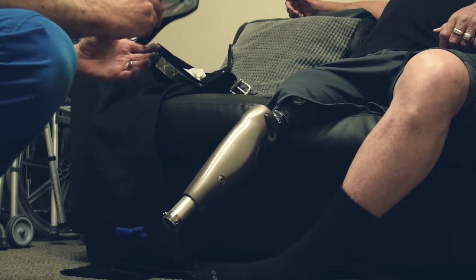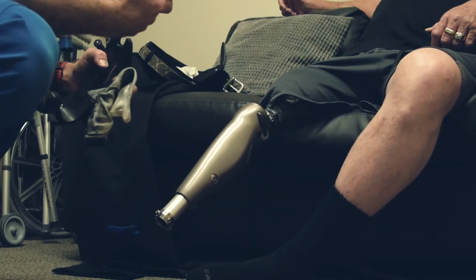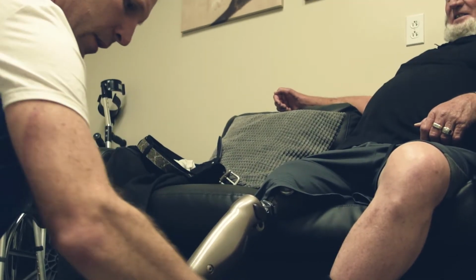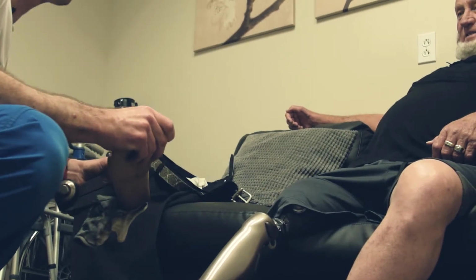Well, good. Maybe you can put that back together for me. I can. Let me go wash it out. I don't know if I'm going to have another foot shell for you, but I'm going to look. If I've got one, I'll give you a spare to get you by. But then we need to order you a new one. Okay. All right. Give me a second. Thanks.